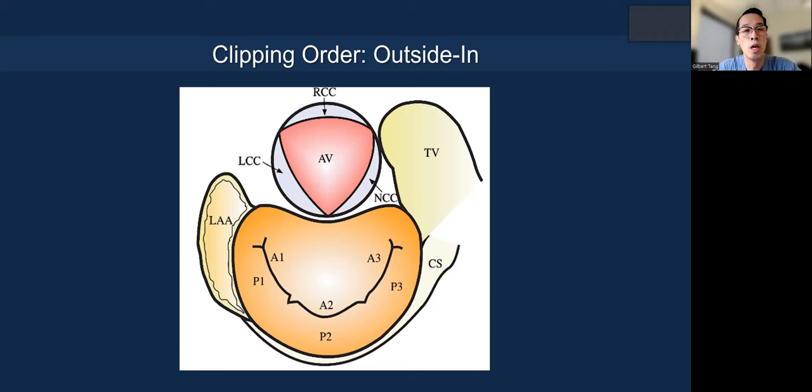How do you pick the order of the clips? We like to say it's outside-in — you go from the commissure if there's pathology there, and work your way towards the center. If you put one in the middle already and there's another pathology next to it, you render a problem with a smaller orifice and have less room to maneuver. If pathology is in the middle, start medial to lateral, because medial is harder to get to based on the septum location. If pathology is lateral, start lateral near the commissure and work towards the center.